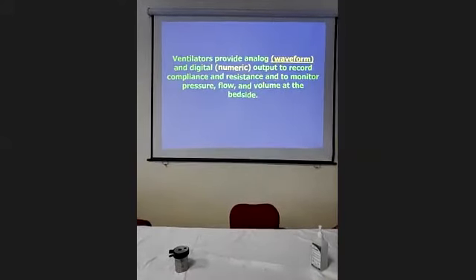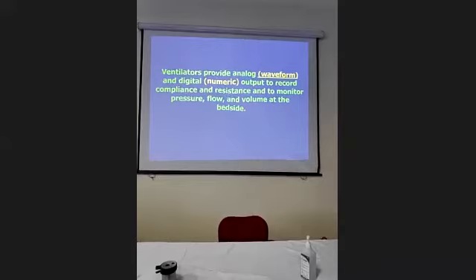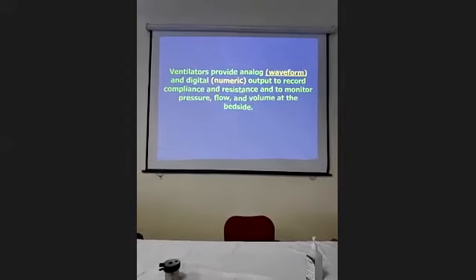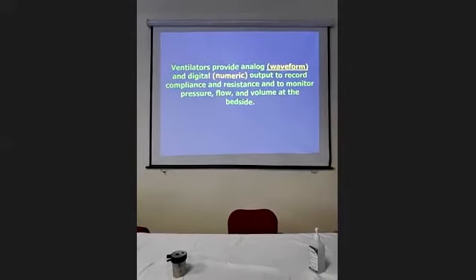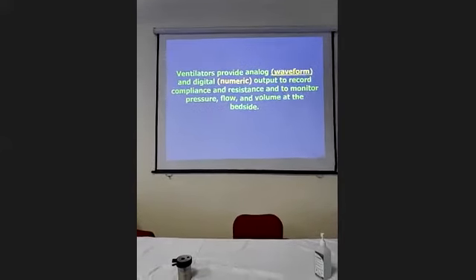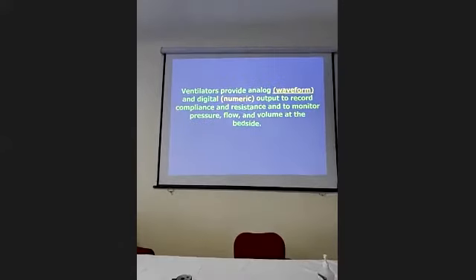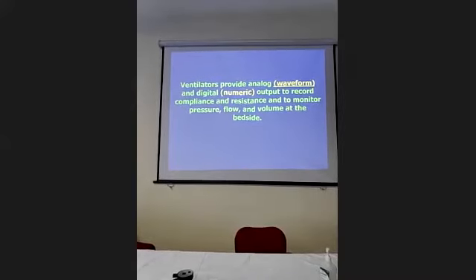Now, the ventilator provides analog waveform and digital numeric output record. As I said, compliance and resistance. Now again, it comes to how you're going to see this compliance and how you're going to measure this resistance. Either by looking at the waveform, if you are an expert and can see the waveforms properly, because these waveforms are actually the mirror image of respiratory mechanics. Like ECG, when you talk about the heart, it is the ECG which tells us how the heart is functioning.